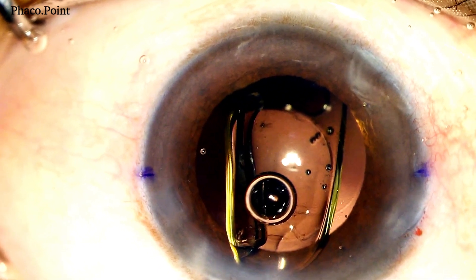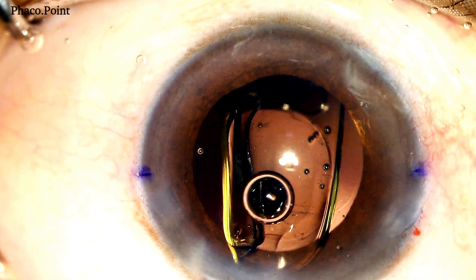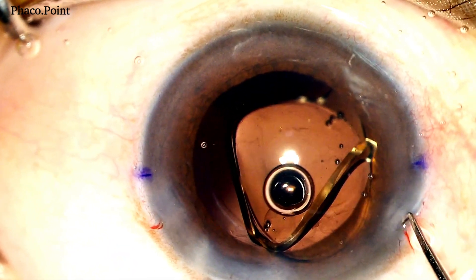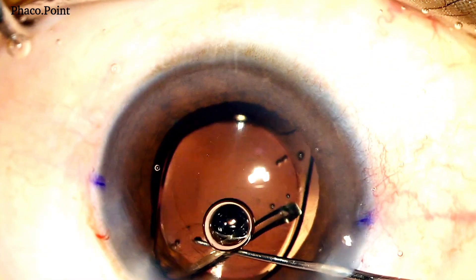When the entire IOL is injected, you have part of the optic in the bag, part of it in the anterior chamber, and the trailing haptic in the AC as well. The leading haptic lies well within the capsular bag. At this point, it may be wise to put in some more viscoelastic to ease the implantation of the rest of the IOL within the capsular bag.